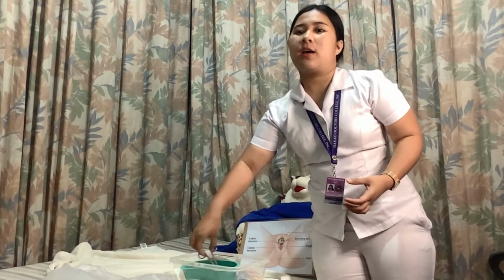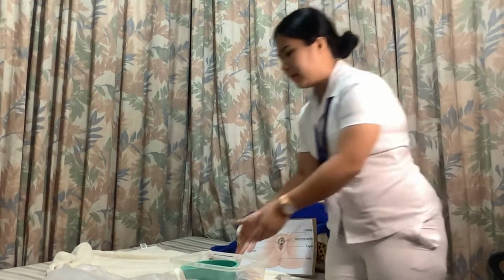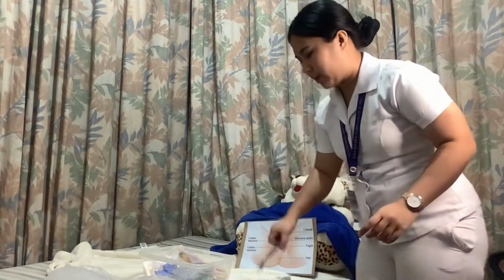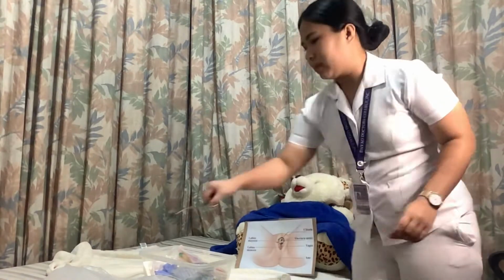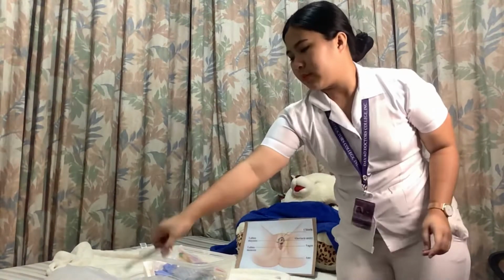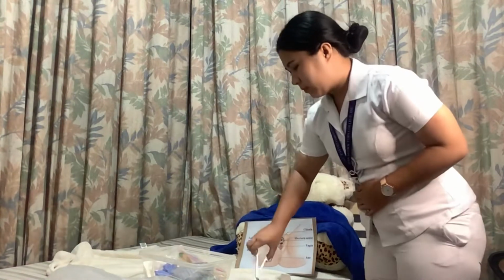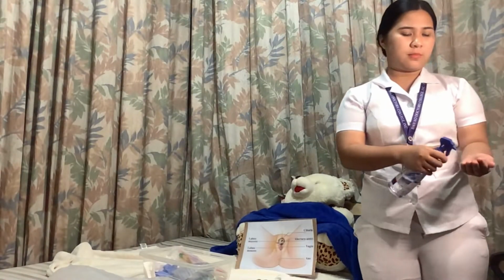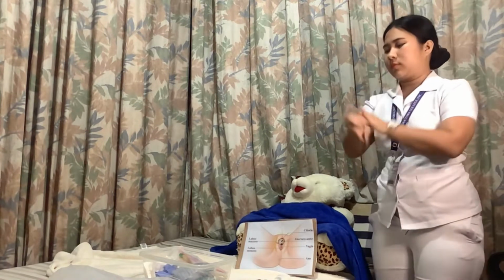So using a sterile forceps, clean the area using a cotton ball with the betadine. Next, open the set, observing sterile technique, and put on sterile gloves and put the eye sheet on. So I'm gonna put my gloves on.